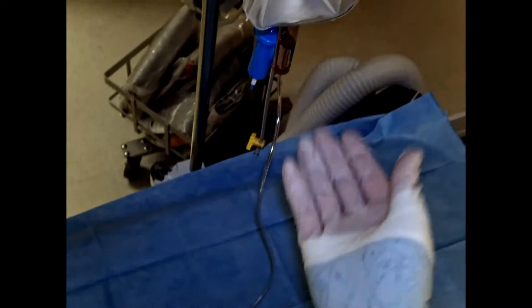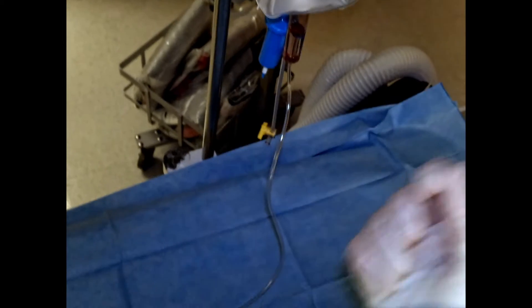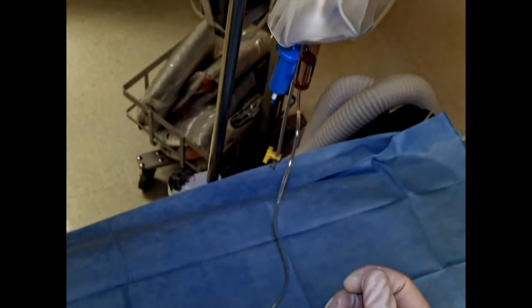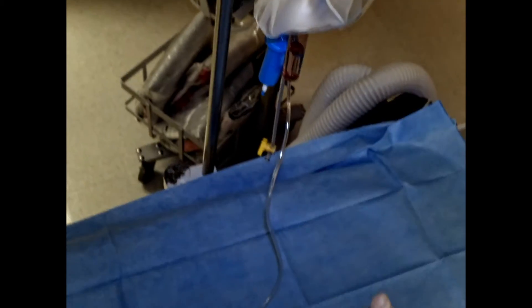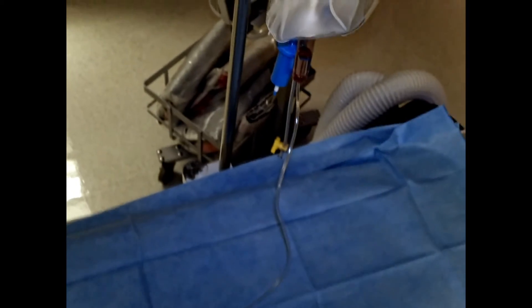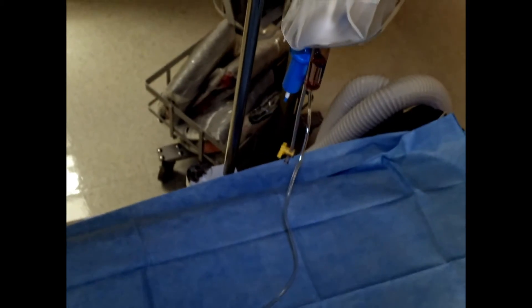If the drip chamber is too high or too low, you're either going to suck air into the system or you're not going to be able to see what your rate is. So you want to make sure that's taken care of.